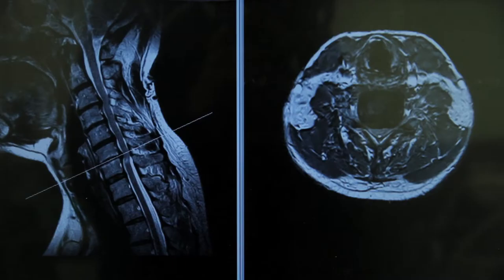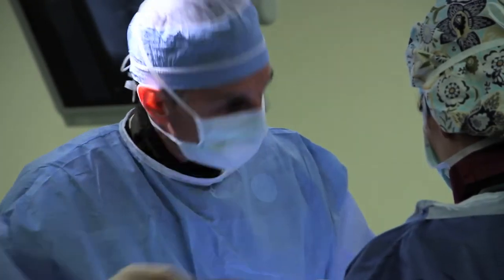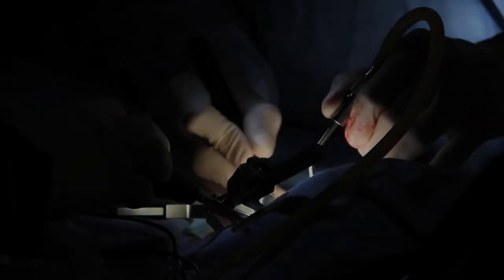I'm going to use a novel device — a cage that has an integrated plate into it that's very low profile and offers a less invasive approach to reconstructing the spine. A standard anterior cervical approach is taken to the disc space of interest. The procedure is performed under a microscope.